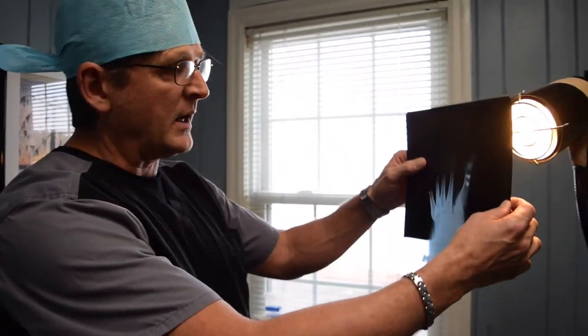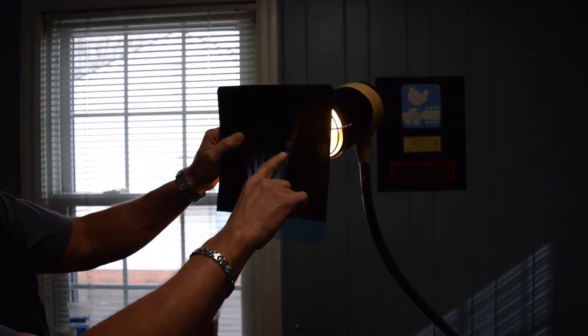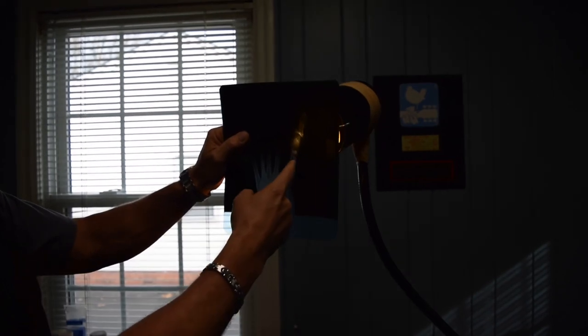with minimally invasive surgery. Let me show you her x-rays, and first I want to show you under the hot light here just to give you an idea how bad the correction she got with the traditional surgery was. You can see how much varus attitude her Hallux has. She had an osteotomy performed here, there's screw fixation here, so this is becoming very painful, and she's getting a hammer toe problem here in the Hallux as well. So this is a multifunctional thing we'll have to correct.